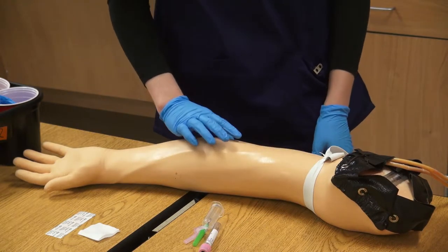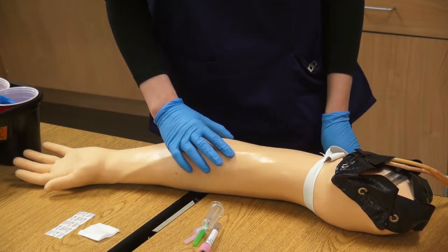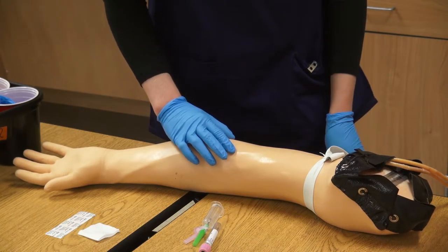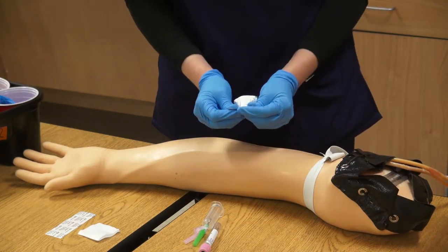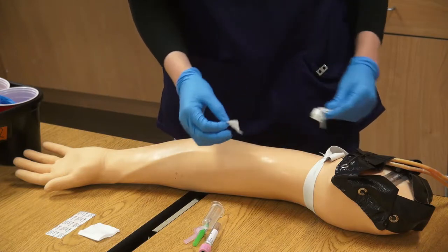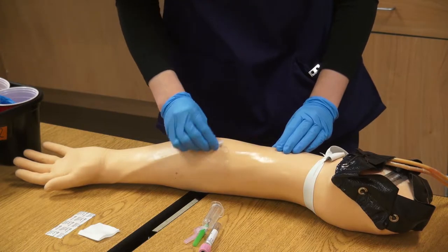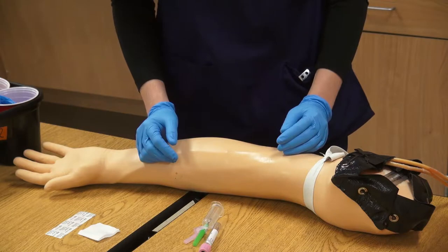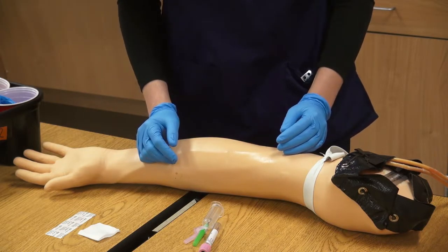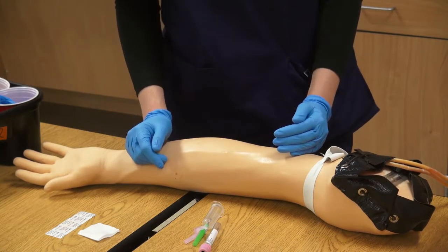After applying the tourniquet, you will palpate to figure out which vein you will use. The most used vein is the median cubital. After locating the vein, open your alcohol wipe and disinfect the area starting from the inside and making a circular motion towards the outside. You will have to wait until it is completely dry so that you do not affect any diagnostic tests. Do not blow on the area, as you do not want to break the sterile field.